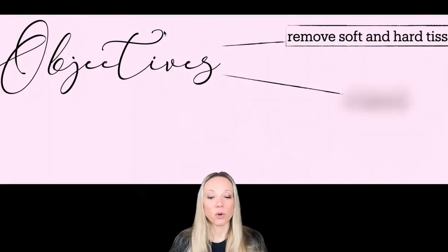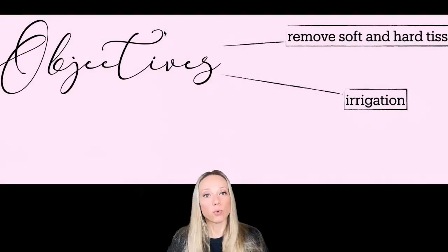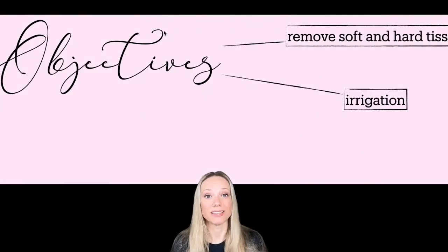And secondly, we want to make room for irrigants, because we don't have to forget that we shape to clean, and so we have to give room for our irrigants to get to the apical third, which is the one in which we need them the most, and we have to allow them to arrive there in a sufficient volume in order to be active against the bacteria.